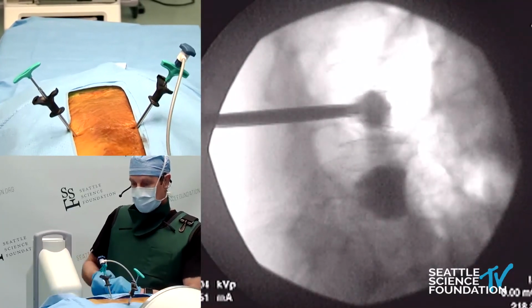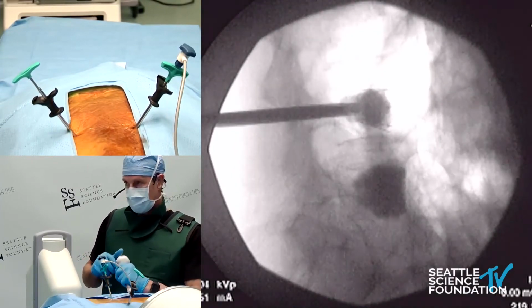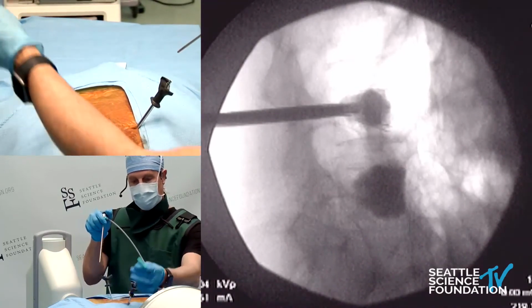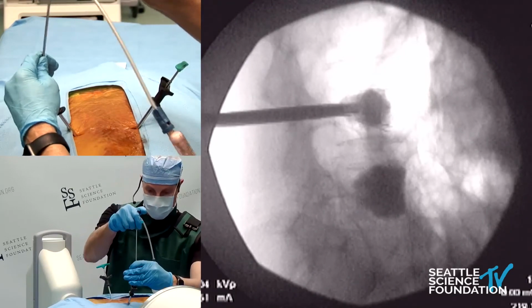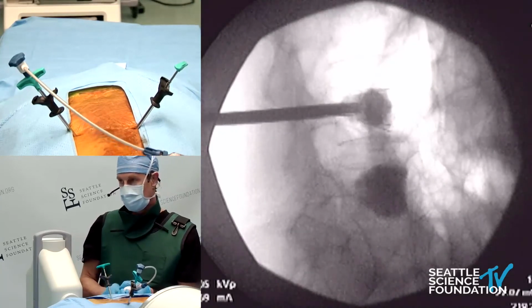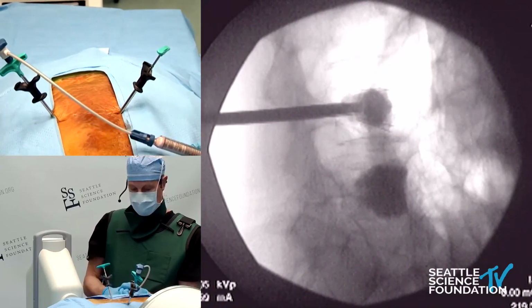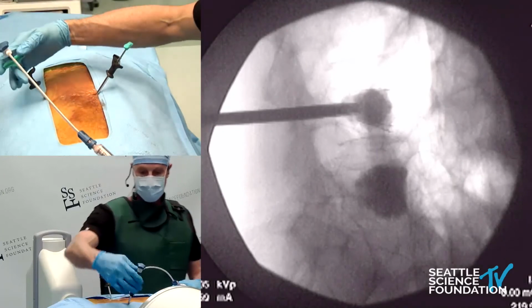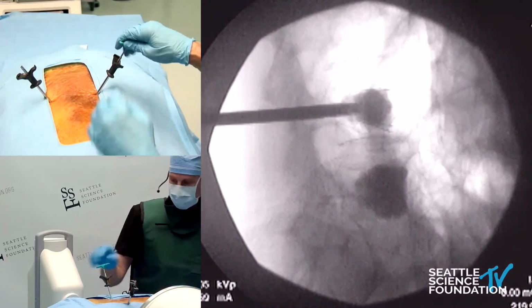Very nice. Very good. I like the feel of that. I'll put a little bit more on the other side. And we'll use the entire contents of this. And that is all she wrote. Very nice. Center, end plate to end plate, and keep in mind you also have the support of the jacks.